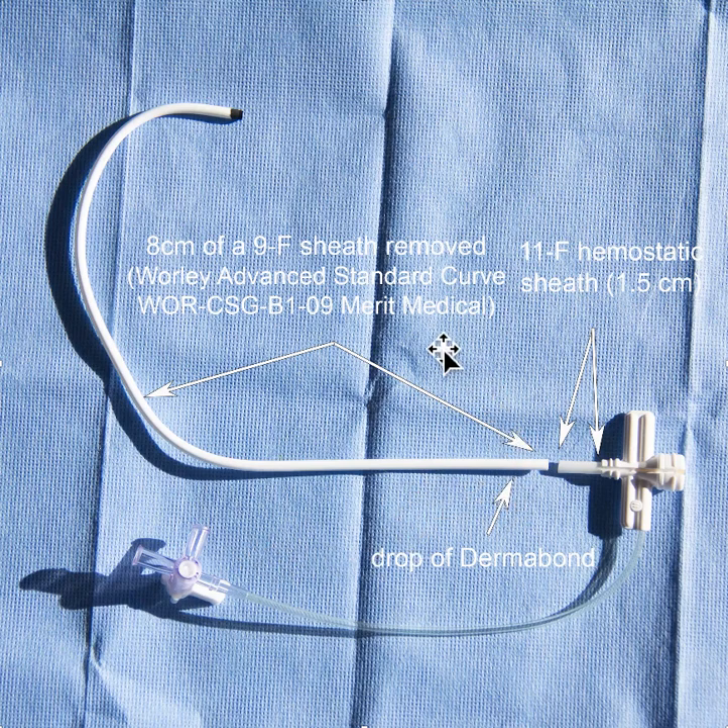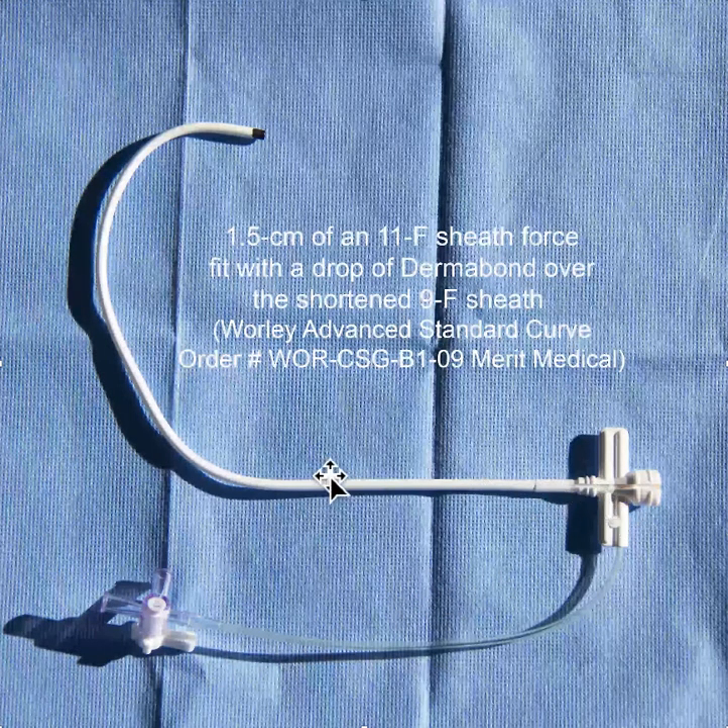If you take the standard Worley sheath, it's too long. But if you cut off 8 centimeters, you can preserve the hemostatic properties by putting a drop of dermabond on there after you cut it off, and then you can force fit an 11 French hemostatic peel-away type sheath to create this type of sheath.